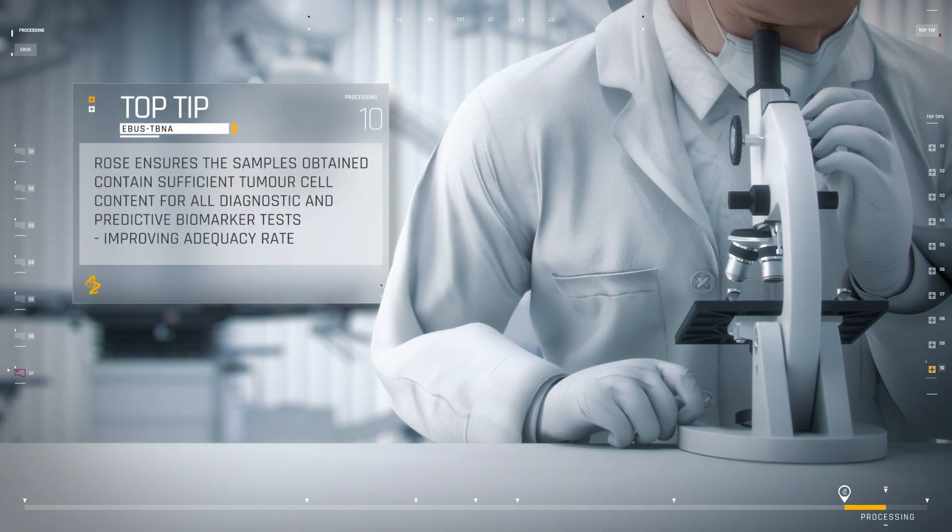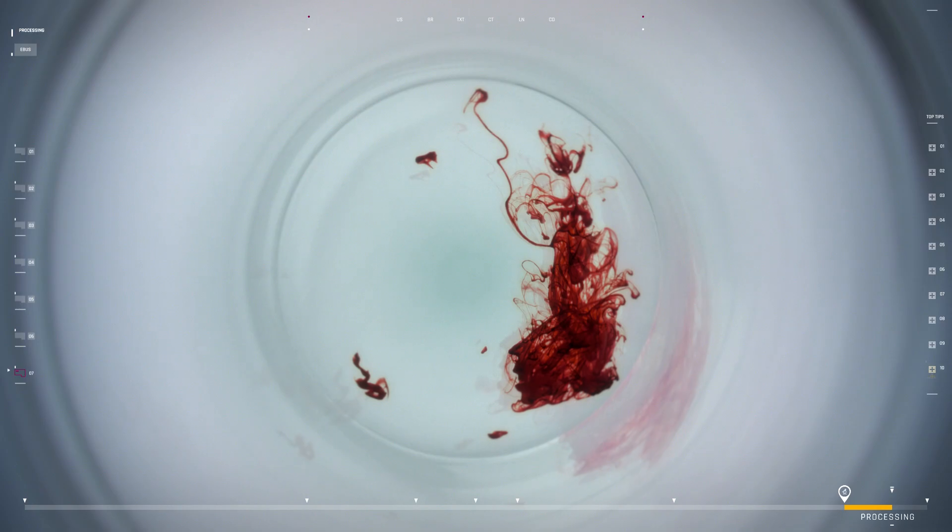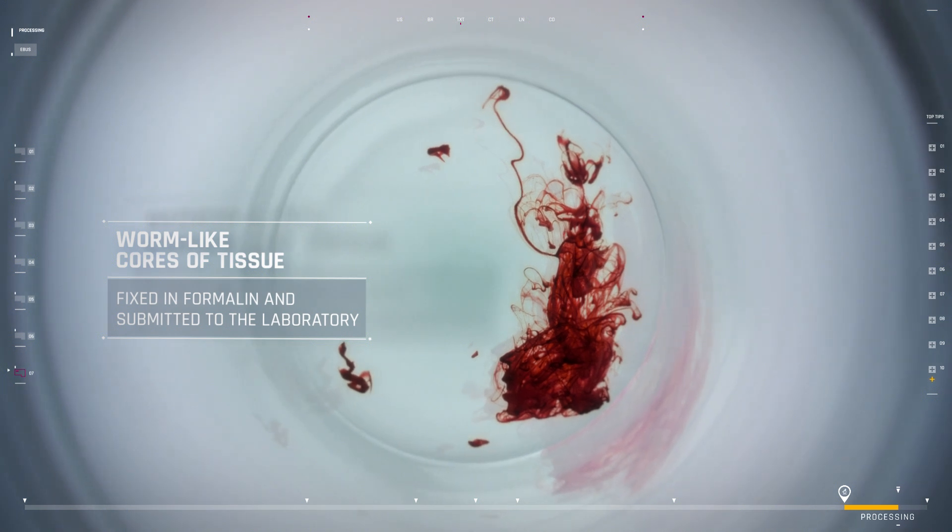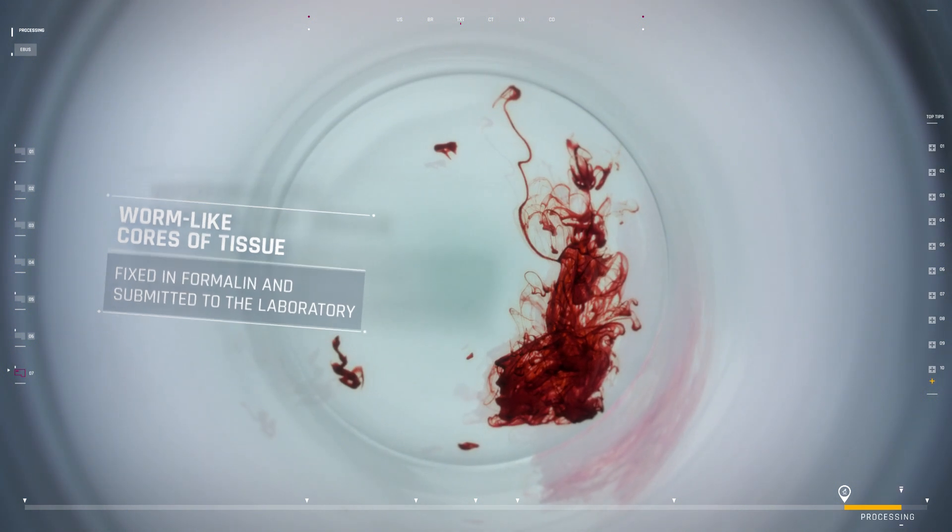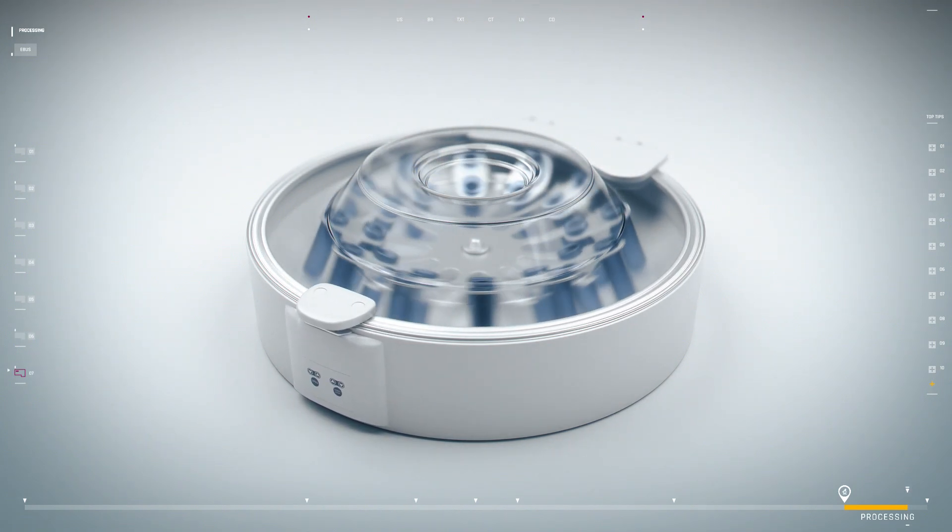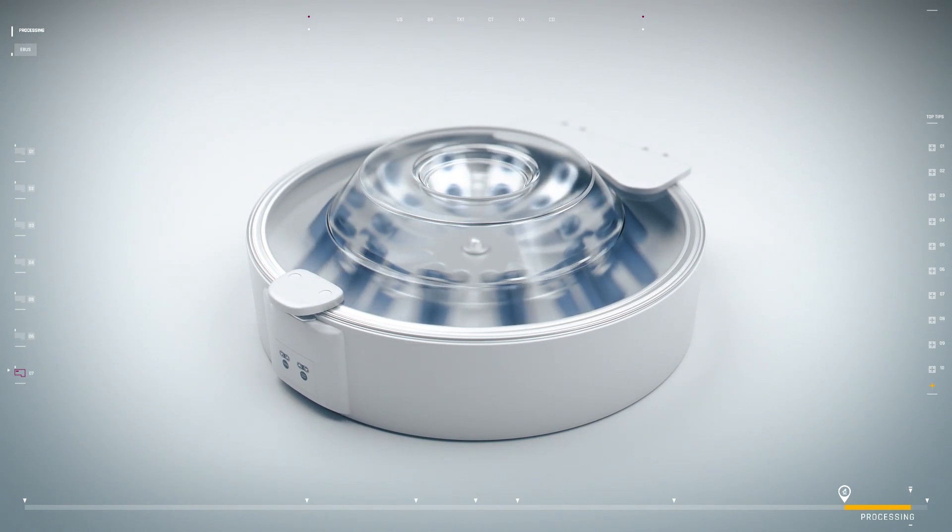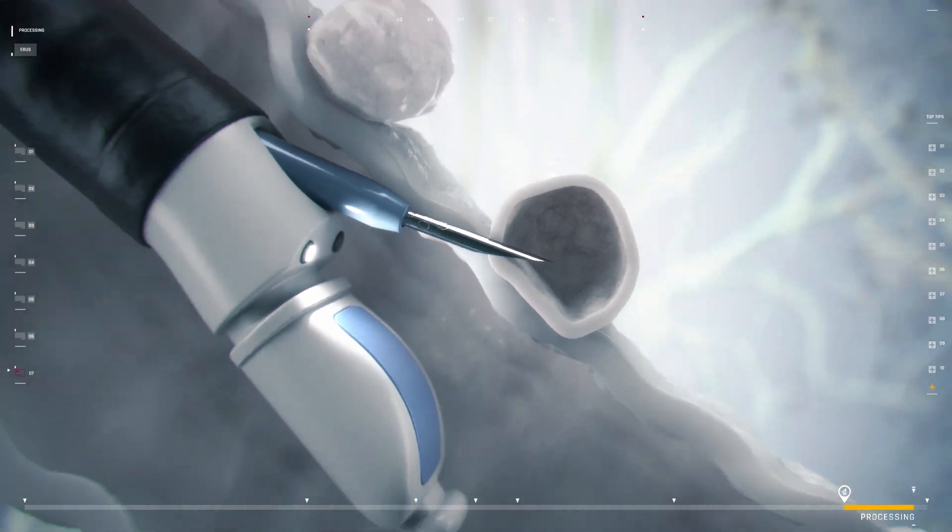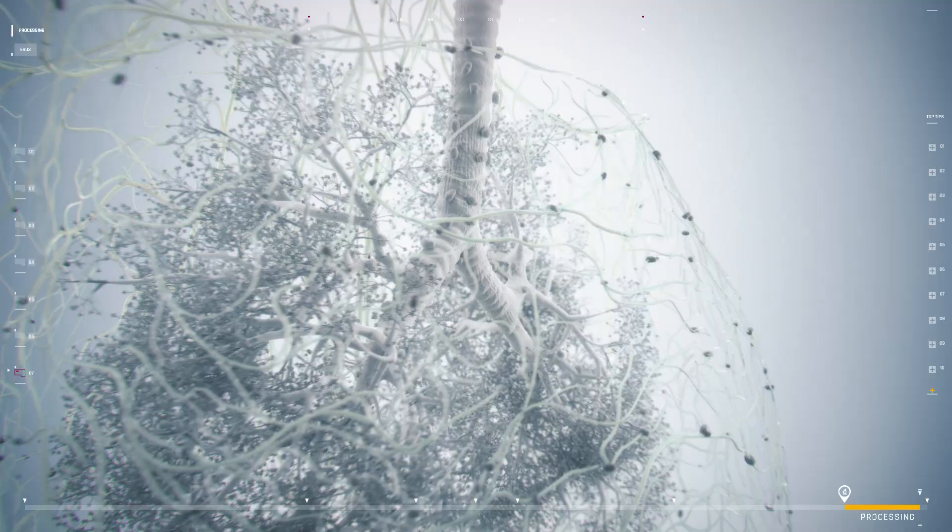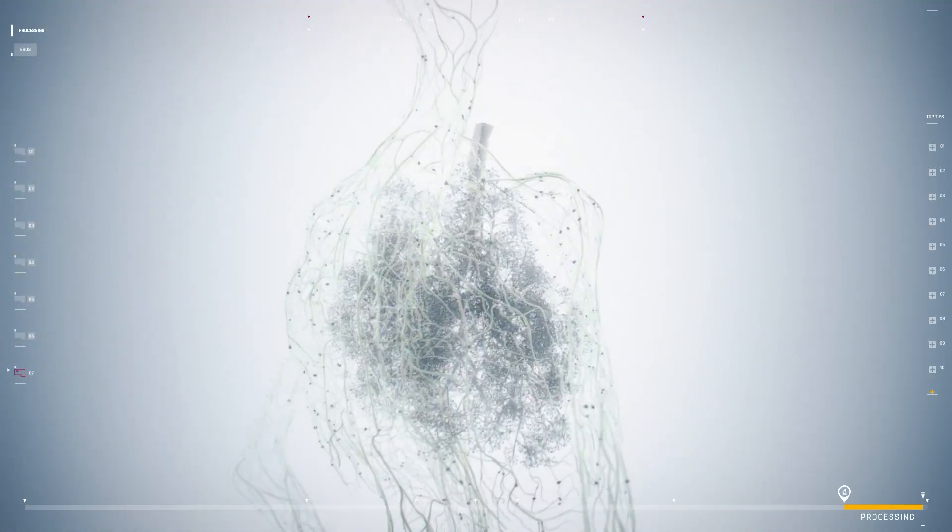EBUS can also provide worm-like cores of tissue that are submitted to the laboratory in formalin. The samples are spun down to provide a cell block and allow further processing like histological specimens. Samples obtained via EBUS should be suitable for establishing a tumor phenotype as well as allowing analysis of predictive biomarkers.